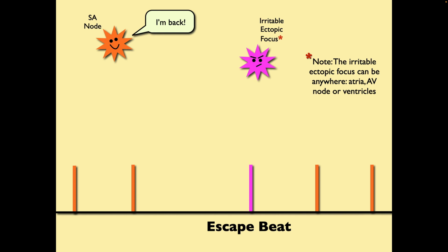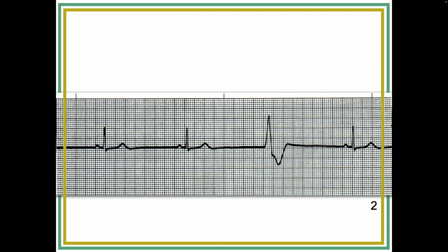So we know why this happens. Perhaps it's a long sinus pause, or perhaps it's a sinus arrest. And the rest of the heart becomes irritable until someplace in the heart, some ectopic focus will fire off. So if you look here, you can see this is not coming in prematurely. In this particular case, it may just be that this sinus brady is so slow that the rest of the heart can't stand it and it starts firing off. But it only fires off one and then the brady picks up again. So it's a subtle difference, but it's there.